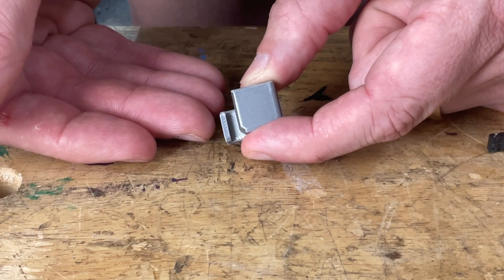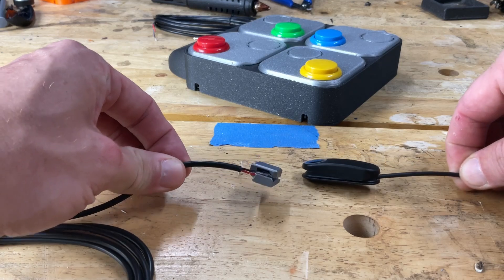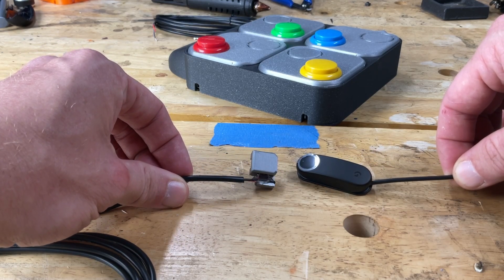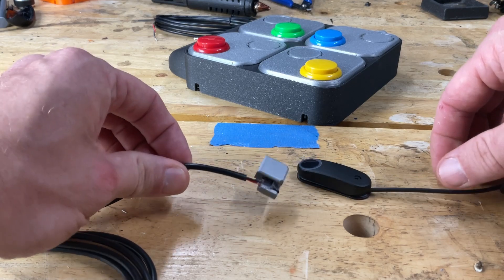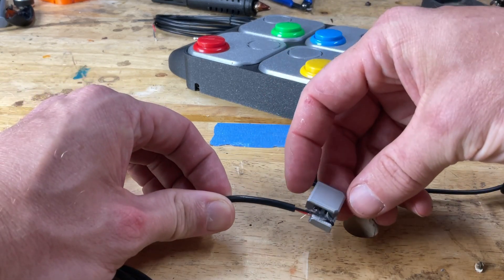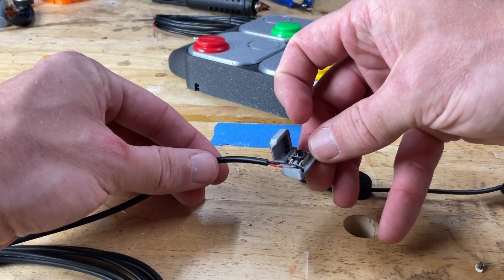Let me show you the completed product. Here's the final result. You can see it compared to the Logitech — it's a little bit thinner, much smaller footprint. And you can see I just used a drop of hot glue here to help secure that in place. You can see the construction of it there.